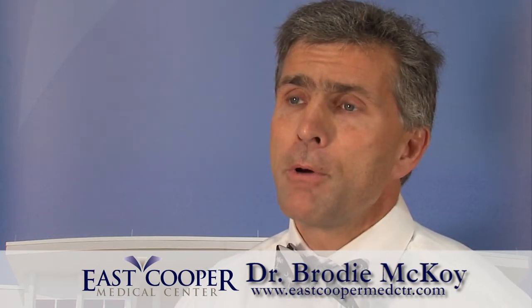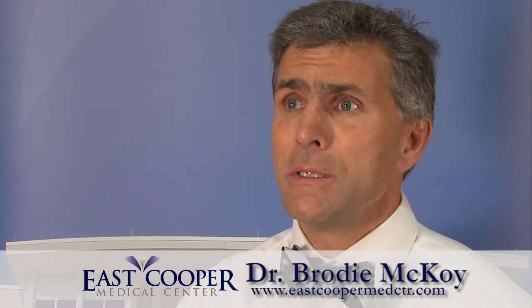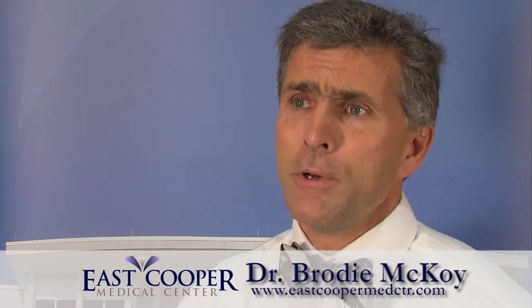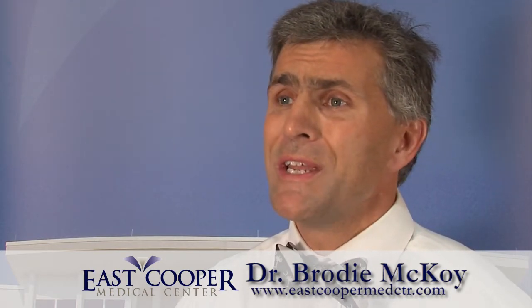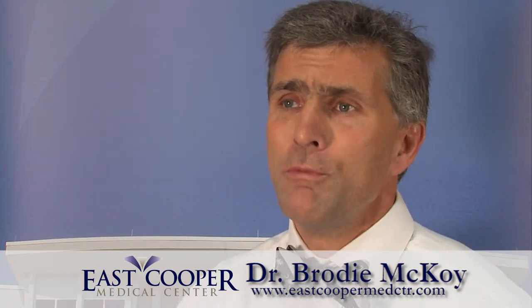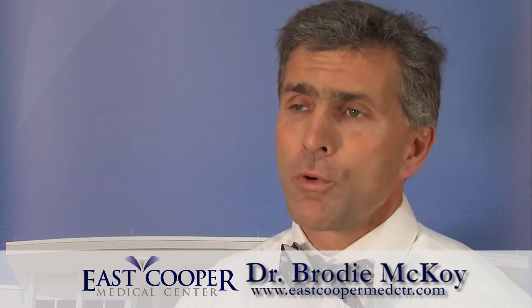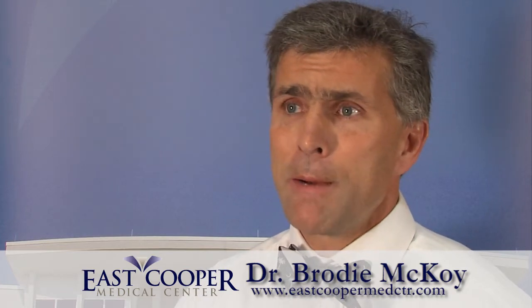The anterior and posterior cruciate ligaments are sacrificed, as well as any normal cartilage that's in the knee adjacent to damaged cartilage. In a partial knee replacement, the anterior and posterior cruciate ligaments are preserved, as well as any healthy articular cartilage. The only tissue that is removed is the damaged articular cartilage. This can lead to shorter hospital stays, quicker recovery time, and less postoperative pain.